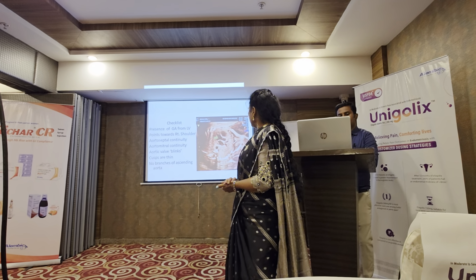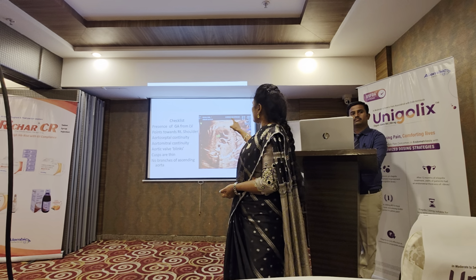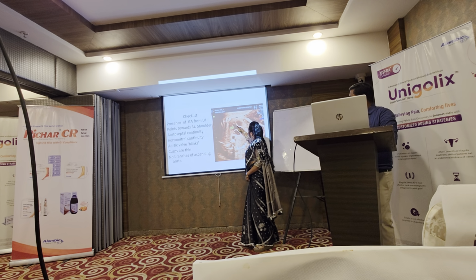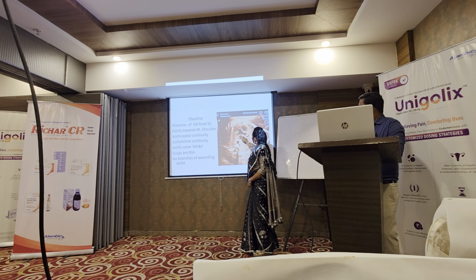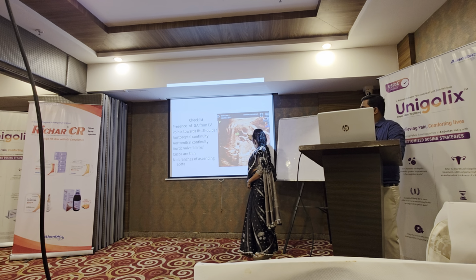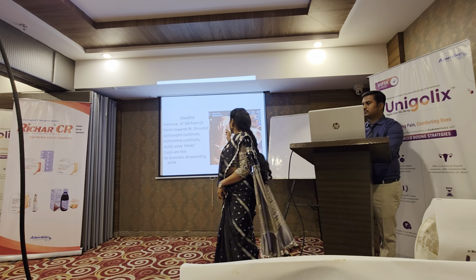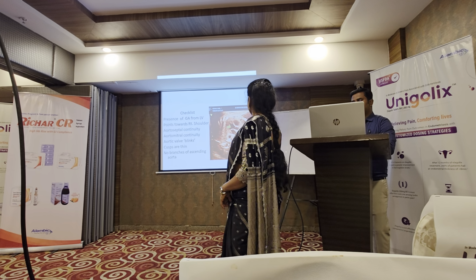Next one. So this is the LVOT. LVOT is very important because you have to see the aortoseptal continuity. This is the left ventricle, left ventricular outflow tract. This is the interventricular septum, and this is the mitral valve that is continuous with the aorta. This is the aortic valve. So this is the septo-aortic continuity. This is aorto-mitral continuity. If these are good, continuous, it means almost you have ruled out VSD and any problem with the outflow tract.